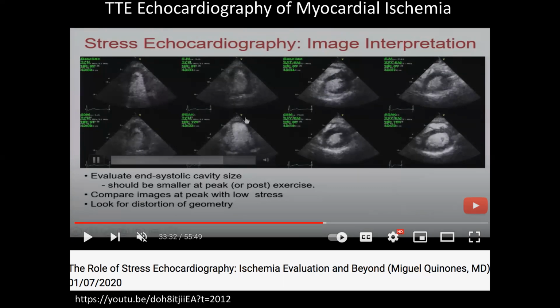So if you have a whole bunch of them in the blood, then they show up as this highly echogenic object. And so people claim you can actually measure perfusion in the tissue by whether or not these bubbles are in the arteries and veins in the tissue. I'm not sure I believe that. But certainly it changes the contrast at the endocardium. Whereas, prior to injecting the bubbles, you could have had a very difficult time seeing that border. Post bubbles, it's pretty simple.